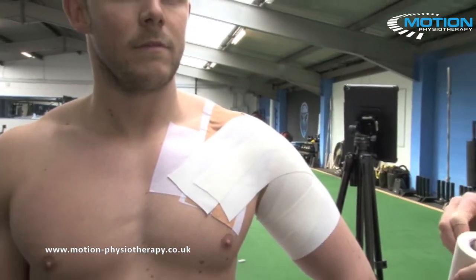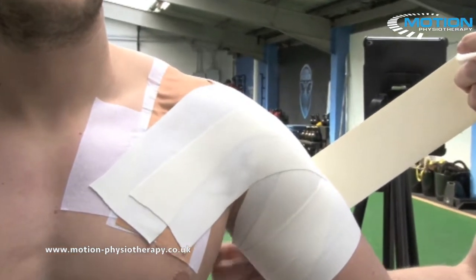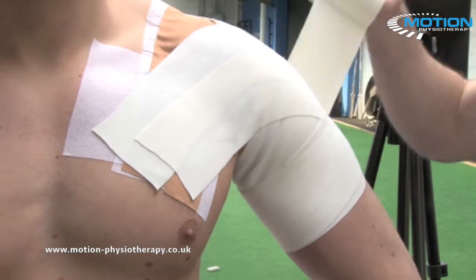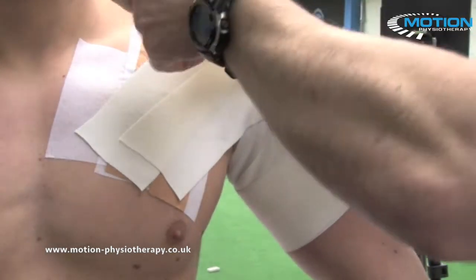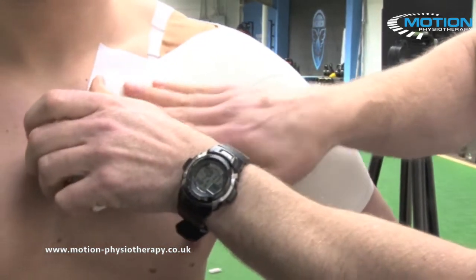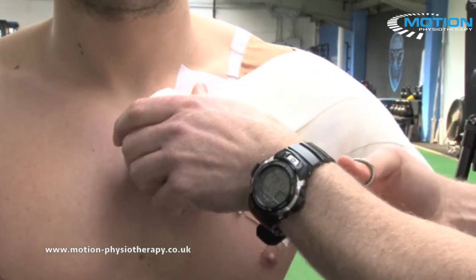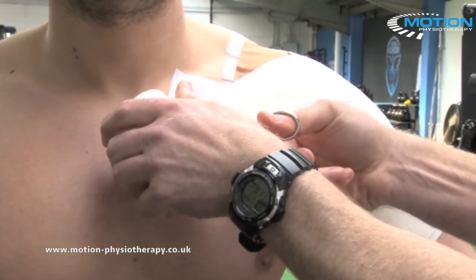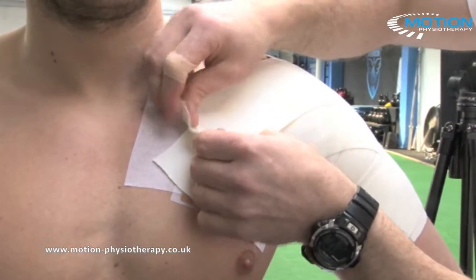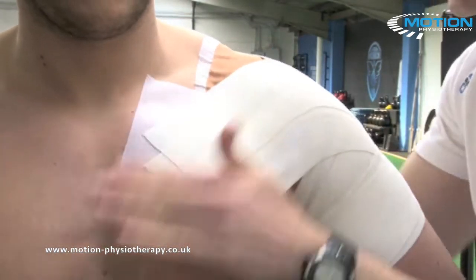One layer to go — the last one is just a spiral on the arm. Ask the patient to contract the bicep, loop up and over, coming over the AC joint and tracking to the mid pec. Apply tension, tension, tension — then nothing at the very end. Smooth it down.